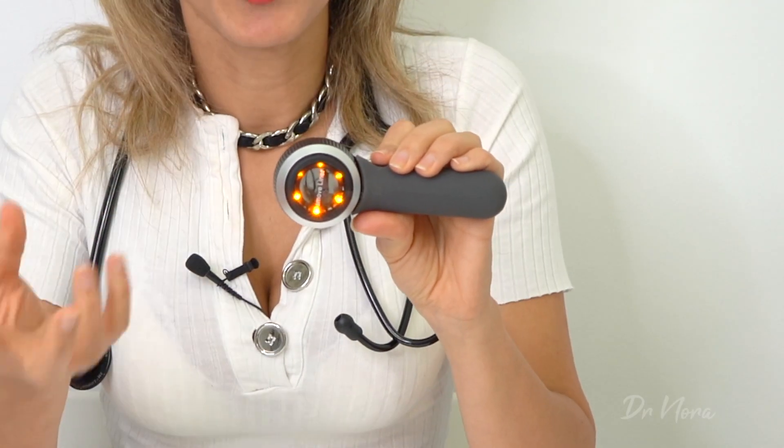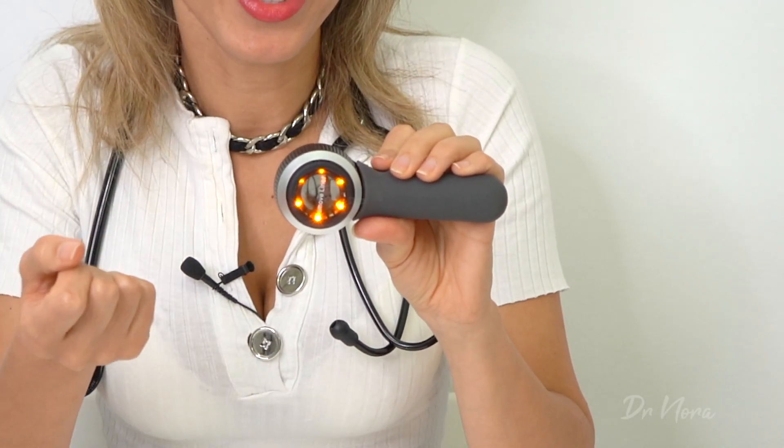This particular dermoscope can be used in contact and off-contact with skin, and you can also use fluid immersion as well. It also has a pigment boost button on the side which, if you press it, allows the colour to pop out of a pigment, giving you that extra diagnostic capability.